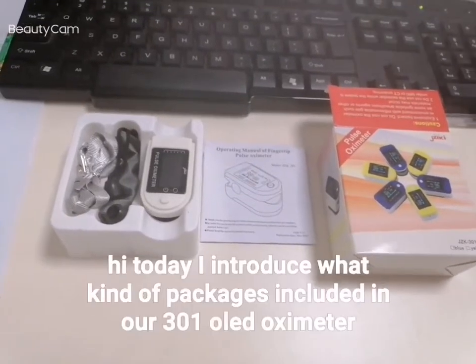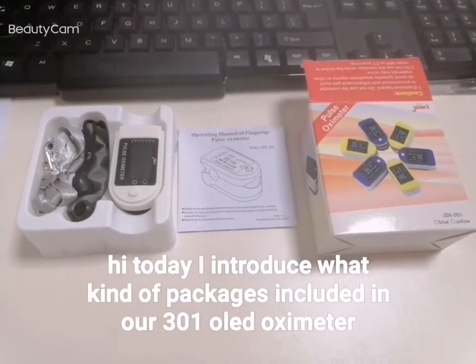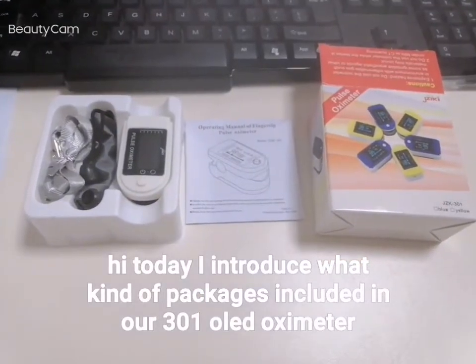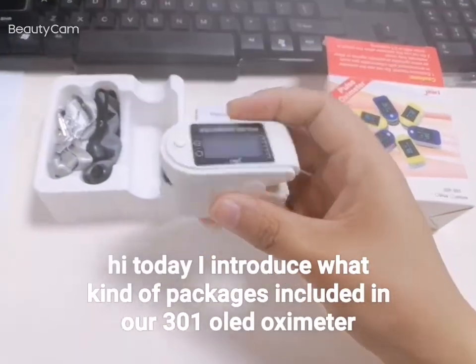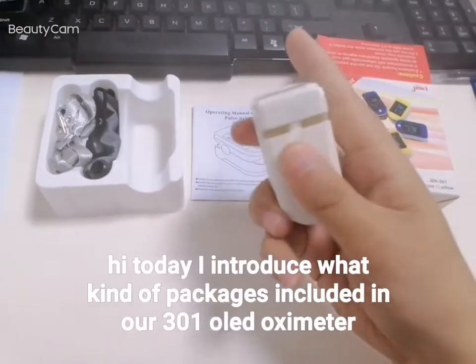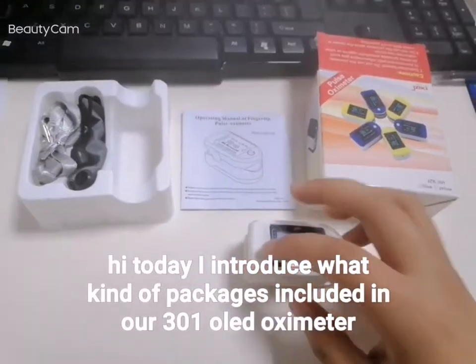Hi, today I introduce what kind of packages the 3D robot OLED pulse oximeter has. Firstly, it has the machine — the oximeter. Usually it has no battery because many sellers do not ship the goods with battery.